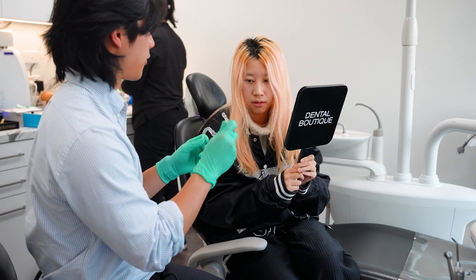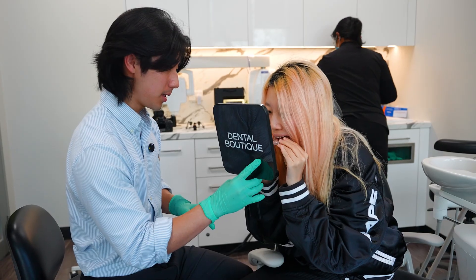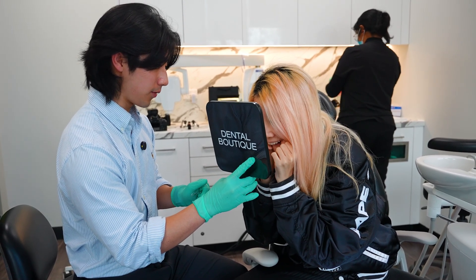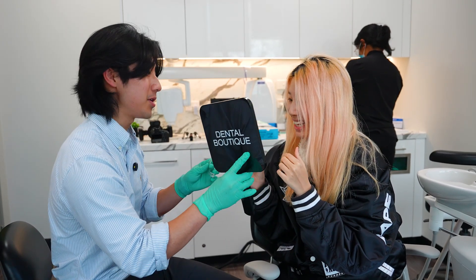Each aligner will be worn for exactly one week. In each bag comes two aligners — one for the top, one for the bottom. Put them in and line them up. Big push at the front — get those front teeth in first and then move to the back. Open up. Does it look good? They're in.